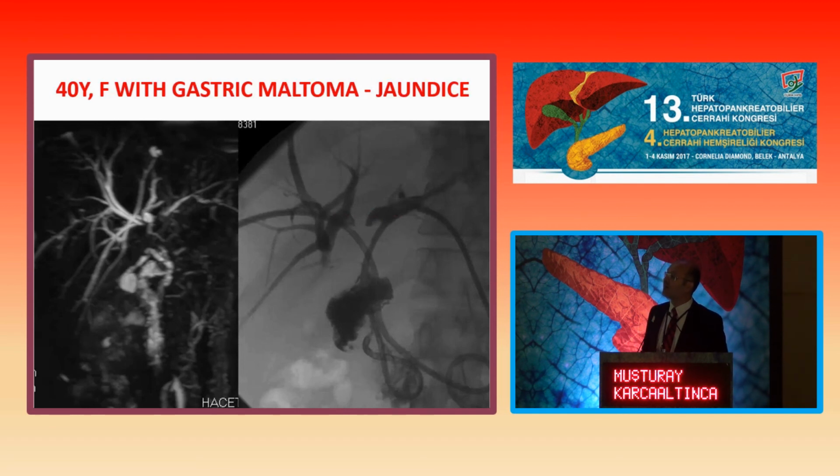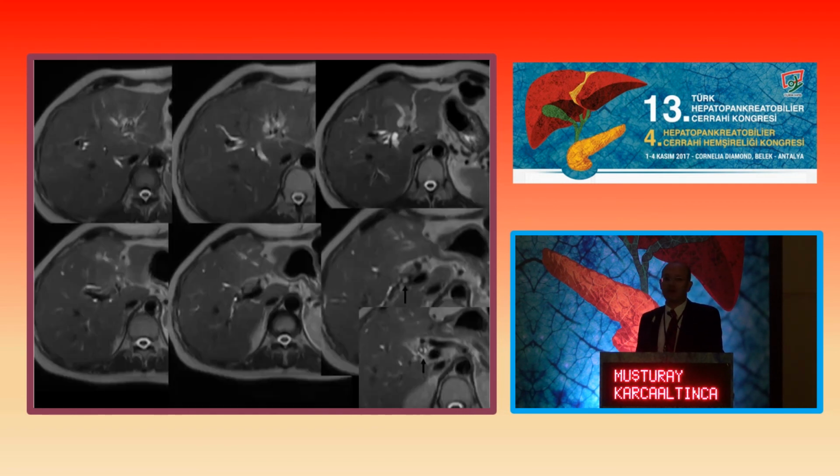So it was a 2005 image. You can see that there is obstruction. We thought that the patient had Klatskin tumor. But when we did the brush biopsy, they were all negative. So our surgeons decided to do surgery to this patient after bilateral biliary drainage.